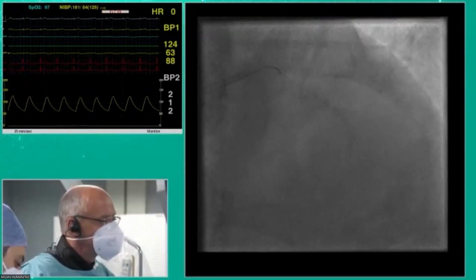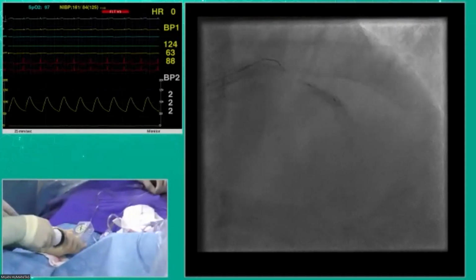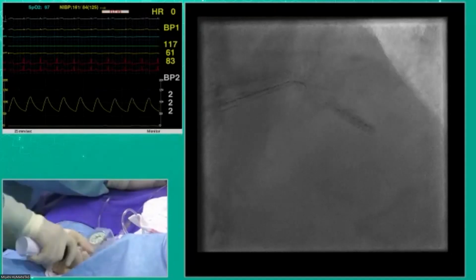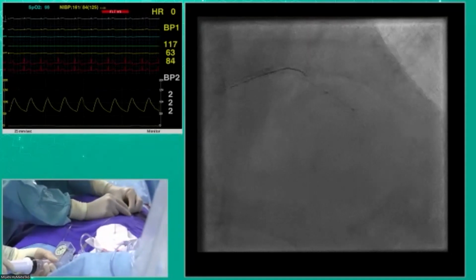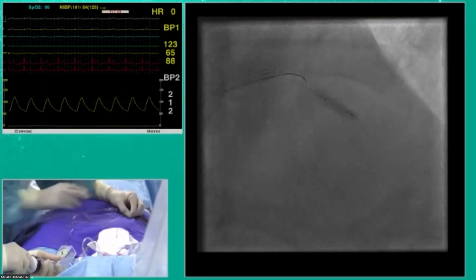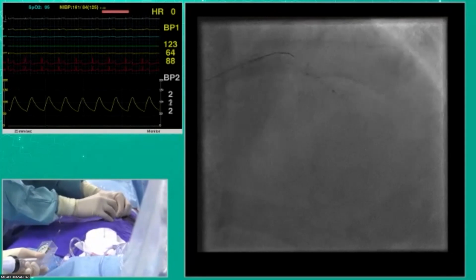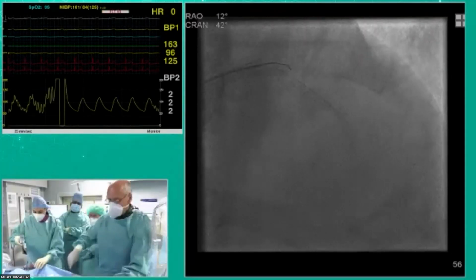But if I had to place a stent distally, I would place a wire also in the septal. I'm a little bit concerned about the septal, and I don't want to lose it. Big septal, huh? He may develop left bundle branch block. Ajay, how often do you wire the septals to protect them? Rarely, very rarely. Only when I have such a big, a little bit compromised one. Very rarely, but it doesn't mean never.